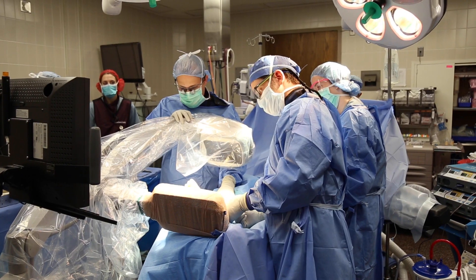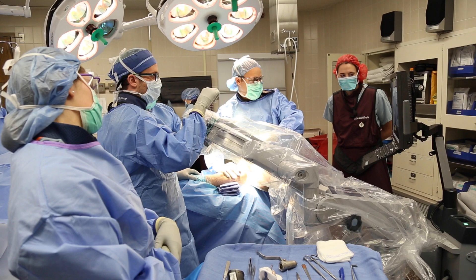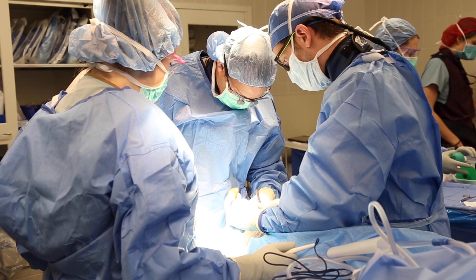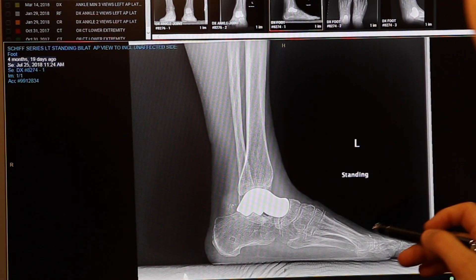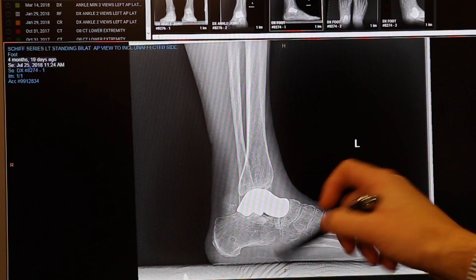Once our custom implant is made, we're able to perform a surgery in which the bad bone is removed and the actual metal talus is inserted. Just like a hip or knee replacement where bad or arthritic bone is replaced, it's a very similar process to what happens with this talus replacement. This is an x-ray of Ms. Stoneburner taken after surgery, and this is the actual metal bone that was replaced.